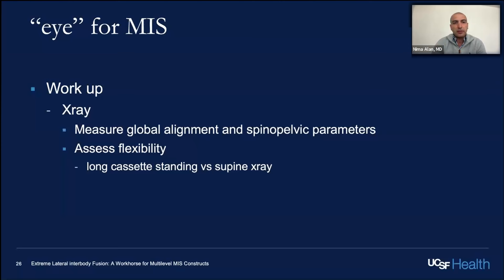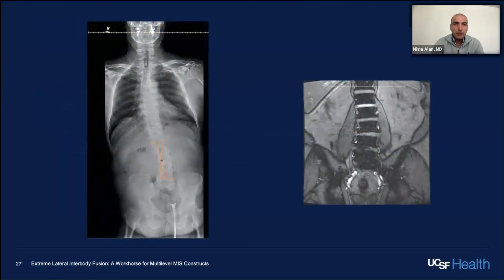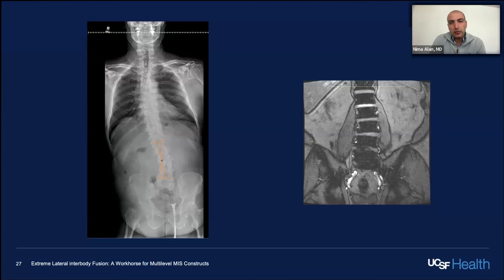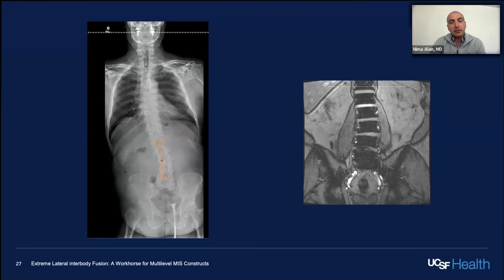You want to measure your global alignment and pelvic parameters — that stays true for any patient. One of the important things is assessing flexibility and getting long-cassette x-rays both in standing and supine. If you don't have supine x-rays, you can look for opportunities to substitute. This patient has degenerative scoliosis with a coronal shift towards the concavity of the curve. Without long-cassette x-rays, on the scout view of the MRI, I can see the curve is essentially corrected just by the patient lying supine.